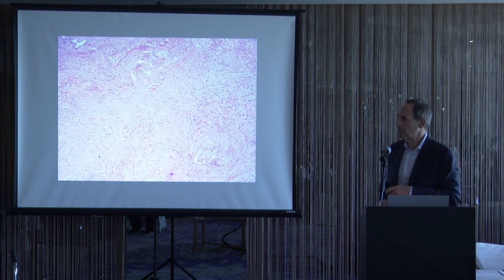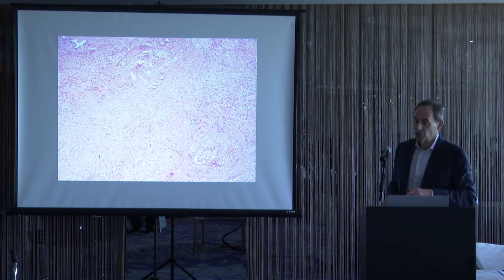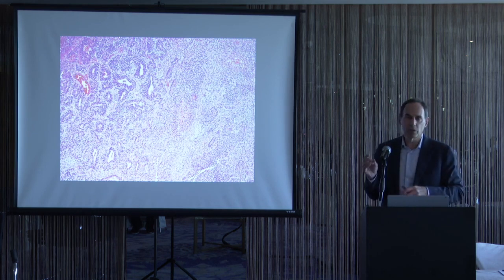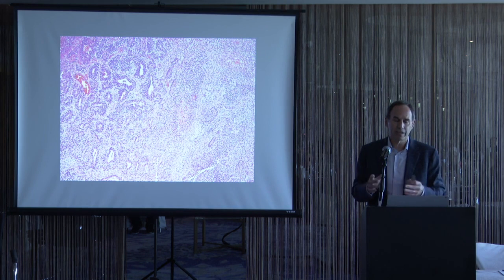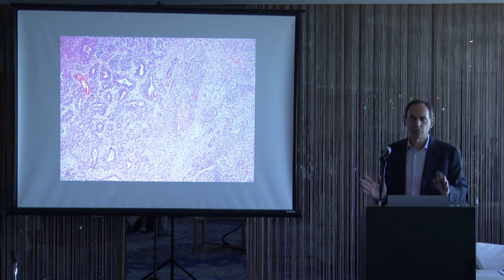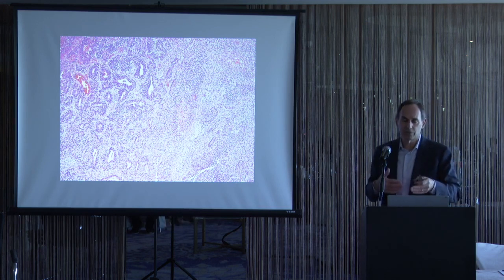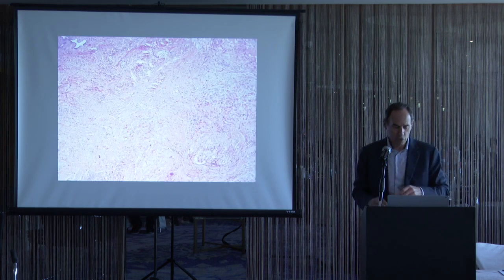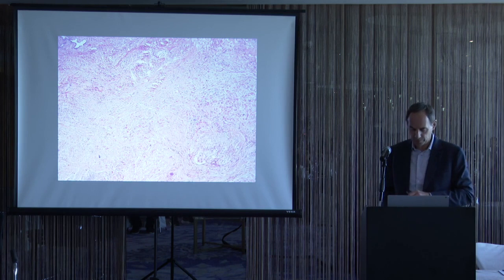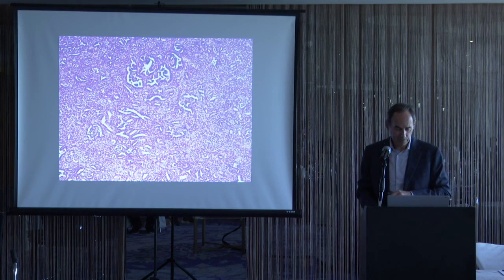The other common pattern that we see is, as I mentioned, rhabdomyosarcoma. So you can see, for example, these immature neuroepithelial components very focally in a teratoma, and as long as they're focal, less than a 4x field, again, you don't mention them. It's only when they sheet out greater than a 4x field, then you say there is a somatic malignancy arising in a teratoma composed of embryonic neuroectodermal tumor, or there is somatic malignancy arising in a teratoma composed of rhabdomyosarcoma. These look just like rhabdomyosarcomas in any other site.